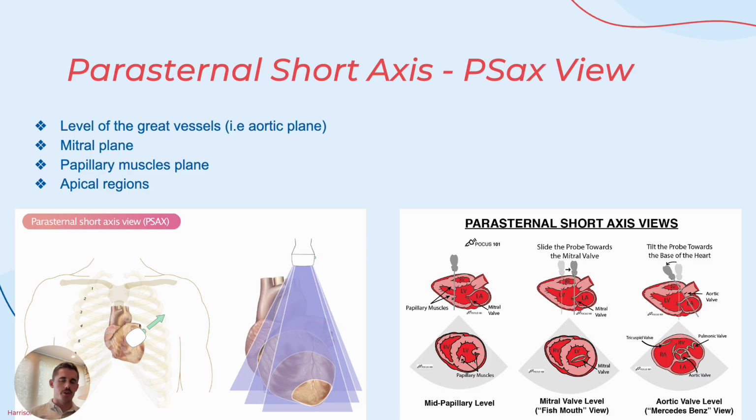Okay, so we are done with the parasternal long axis views, and that took a ton, right? So there were a lot of things that we wanted to see there and a lot of calculations we're doing. Now we're going to move to our PSAX, the parasternal short axis views.